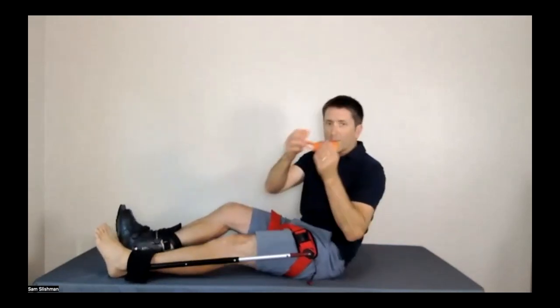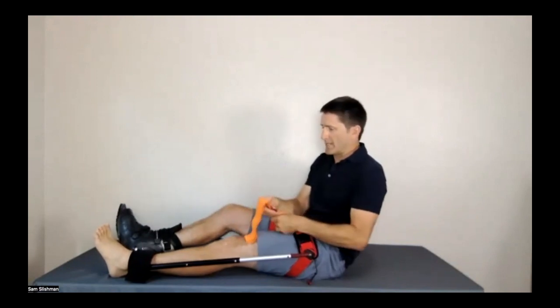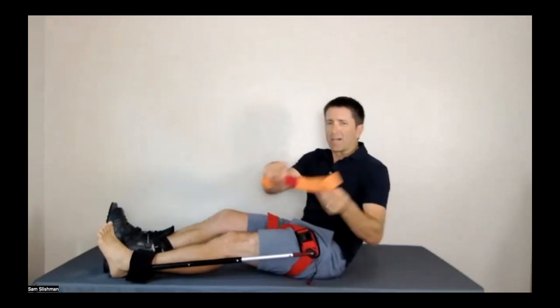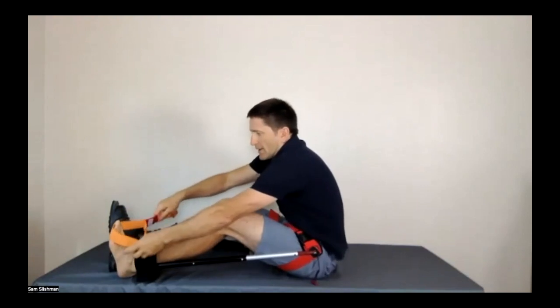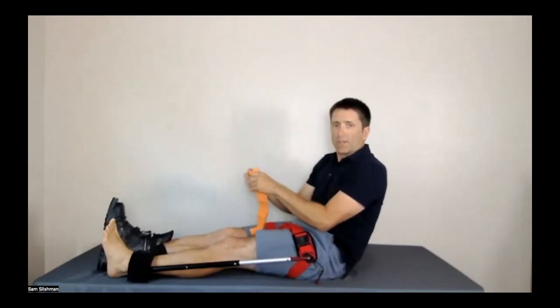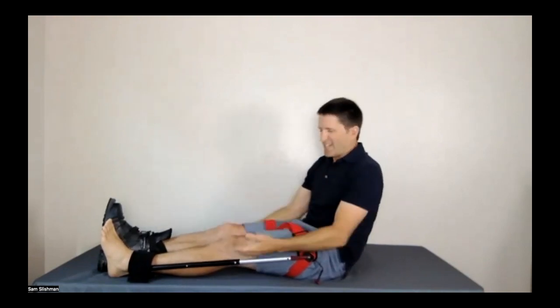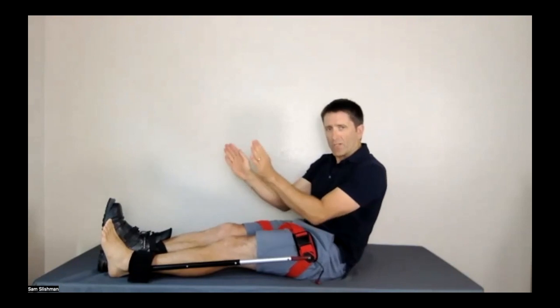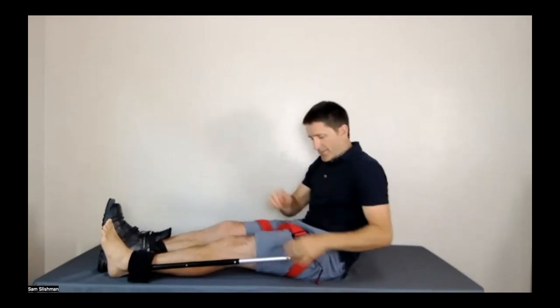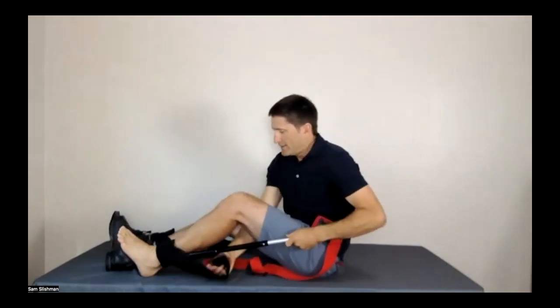The pressure wrap is added for one main reason, to give rotational stability. I'm not going to put you through all that, but you wrap it around one foot and then the other foot, and you get rotational stability from that. And one nice part of doing it that way is you're not having to lift the leg up at all. If you just pull the feet together, then people feel better. All right.